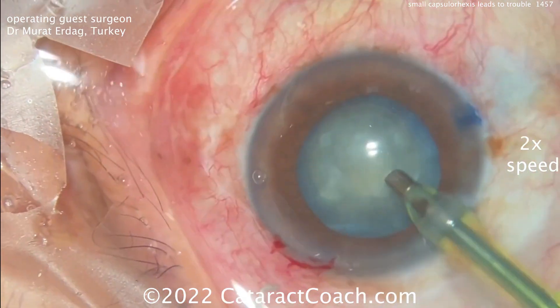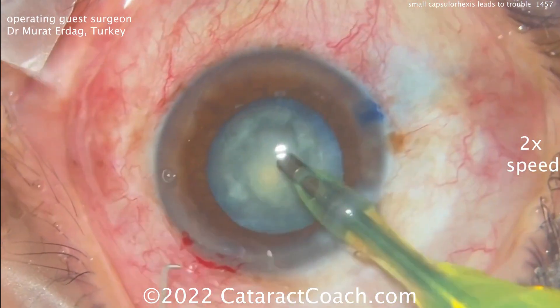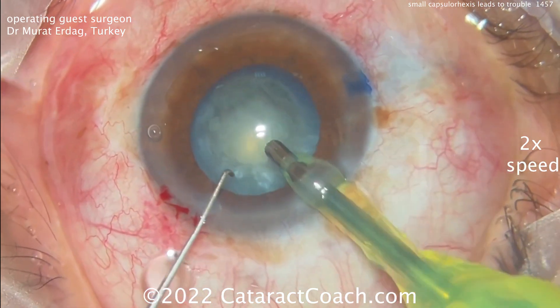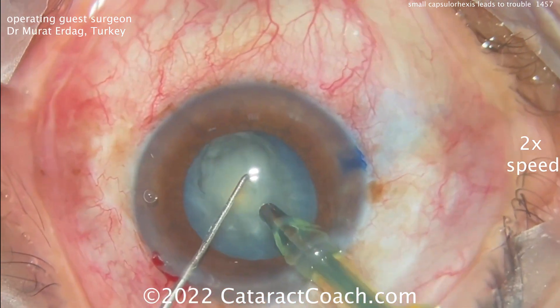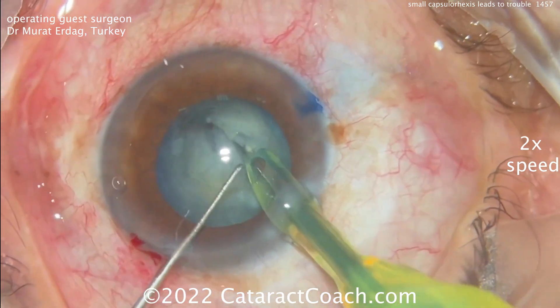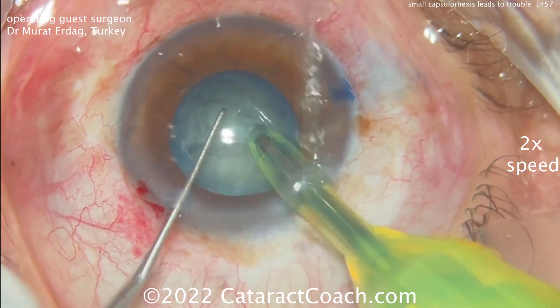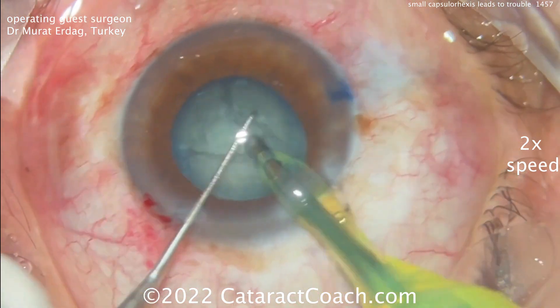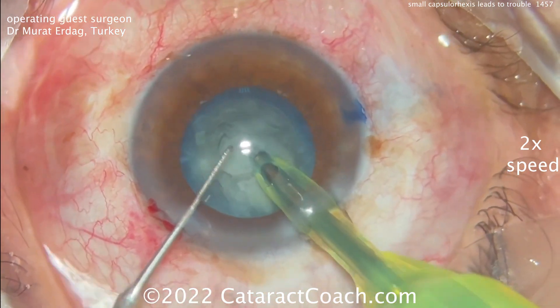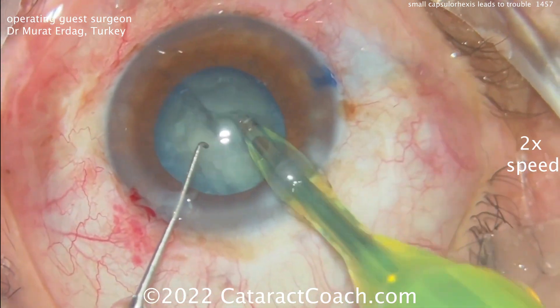Here we have the small Rhexis with the phaco probe going in, cleaning up some anterior lens material. It looks like a chopper or Sinskey-type instrument in the other hand. The technique appears to be a chop — probably a vertical or combo chop. Watch the Rhexis carefully: does it move a lot? That will give you an idea of how much stress is being placed on the zonular support.